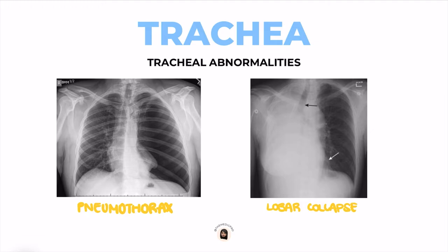Here are two cases of tracheal abnormalities. The x-ray on the left shows a pneumothorax, and you can clearly see the collapsed lung on the left side. In a pneumothorax, the trachea deviates to the unaffected side, which is the right side in this case. In cases of lobar collapse, as shown on the x-ray on the right, the trachea will deviate to the affected side, which is the right side in this case.